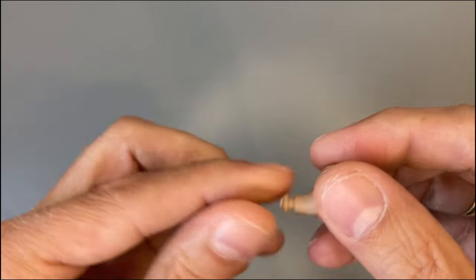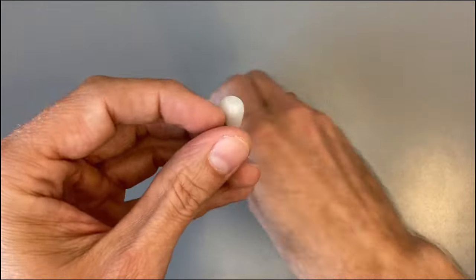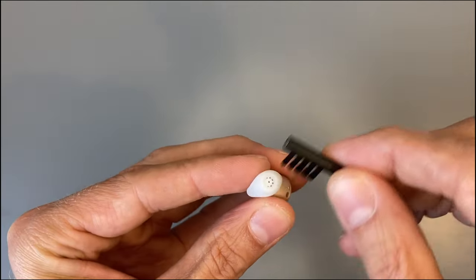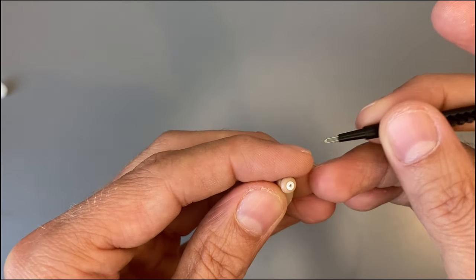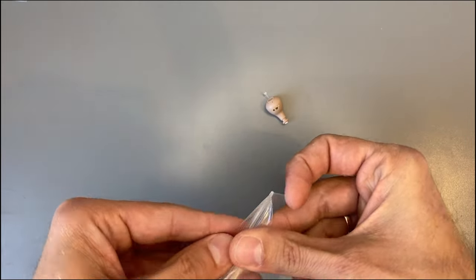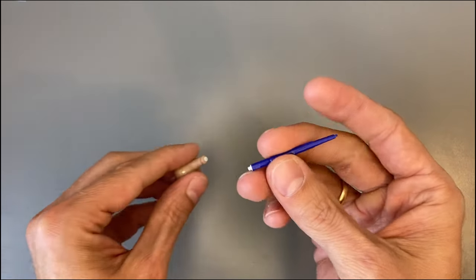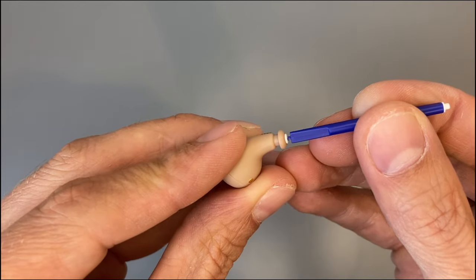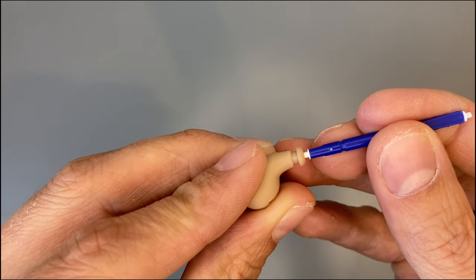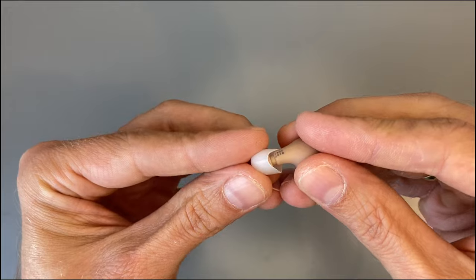For cleaning and maintaining these hearing aids, you can brush the dome or pull off the dome and try to get earwax out with the metal loop, though that doesn't work that well. The hearing aids come with extra wax filters — there's a new wax filter on one end and a very small hook on the other. You stick the hook in the old wax filter, pull it out, turn it around, put the new one in, and that's it. The eardomes are just pressed on.